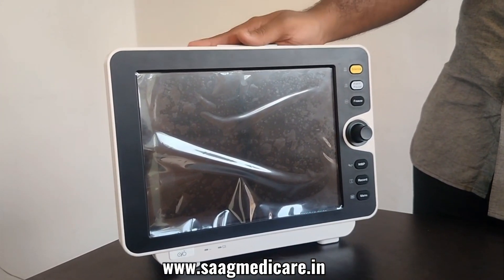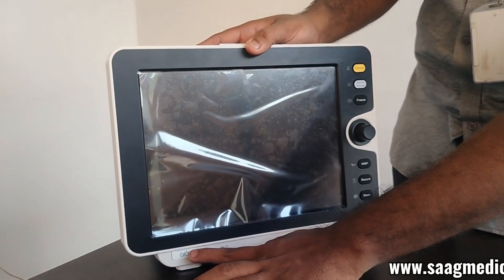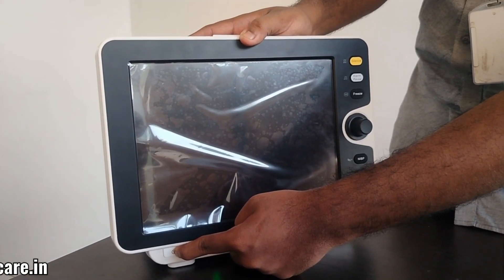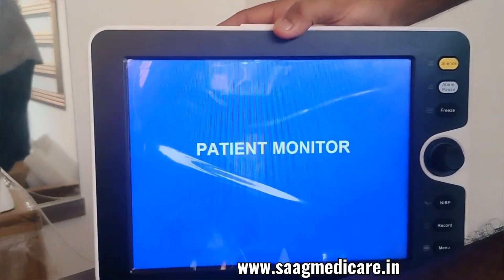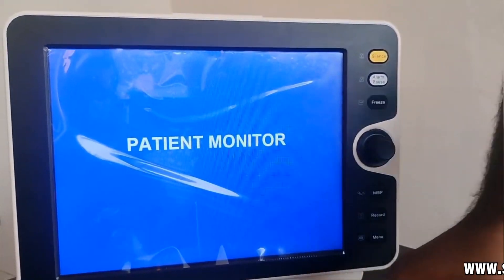Now we can just turn on our patient monitor. To power on, you can see here is the power button — just press this power button. After powering on, you can see there is our battery indicator. We did not connect any power cord, so it is indicating our battery indicator.